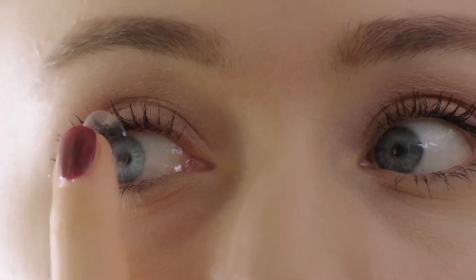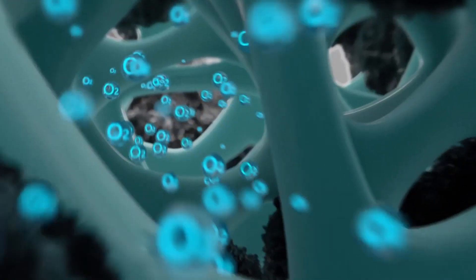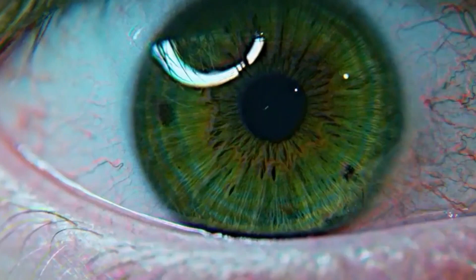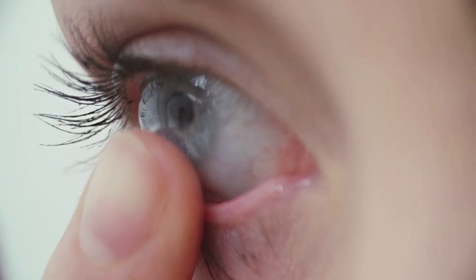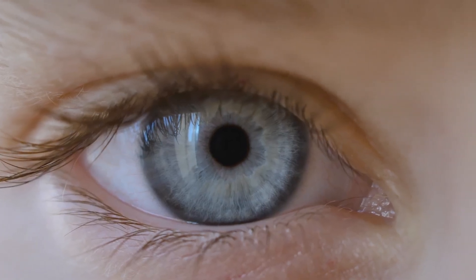Our cornea is the only area of our body that receives oxygen directly from air. That's why contact lenses have large amounts of tiny pores to allow oxygen to reach our cornea. When tear proteins are absorbed into the contact lenses' body, they will block the air, resulting in dryness of your eyes. Removing tear protein and restoring oxygen transmissibility is the key factor for contact lens care.